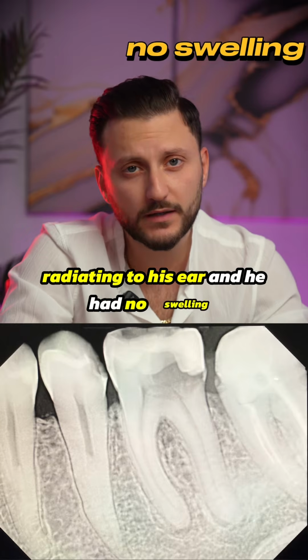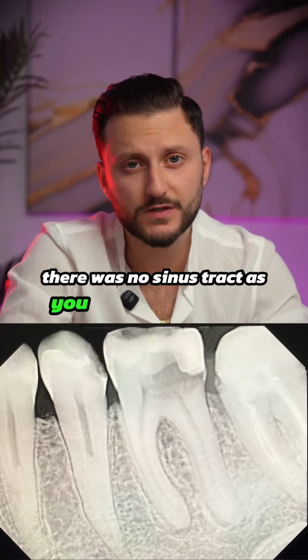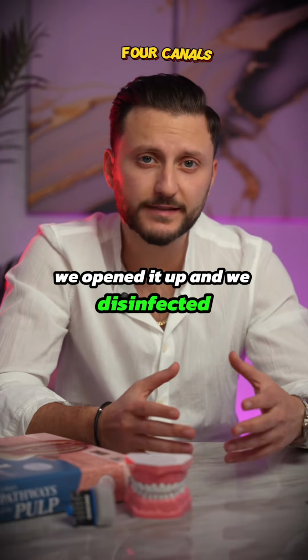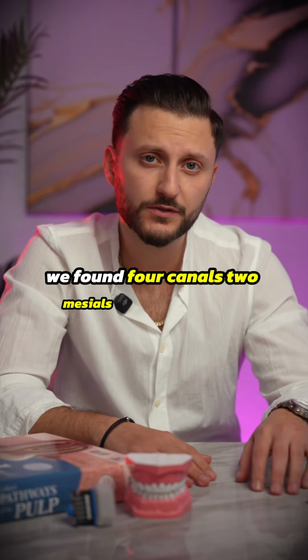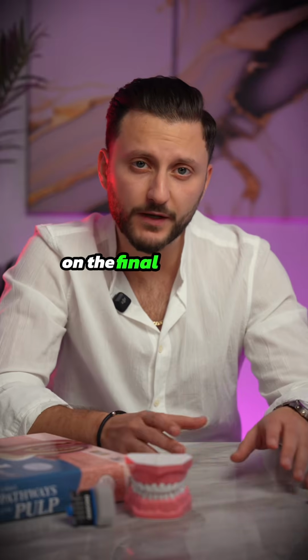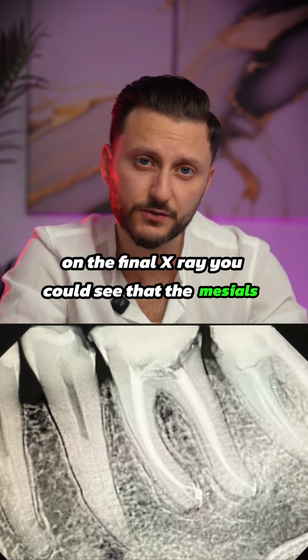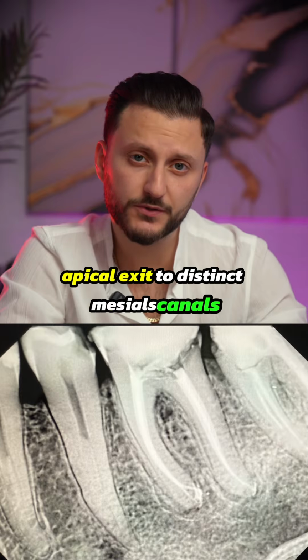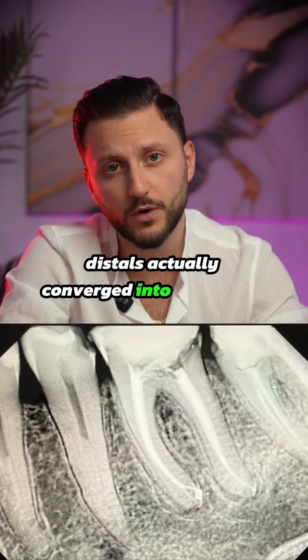and he had no swelling, there was no sinus tract, but as you could see on the x-ray, there's a big decay in the area. We opened it up and we disinfected. We found 4 canals, 2 mesials and 2 distals. On the final x-ray, you could see that the mesials have their own exit, apical exit, 2 distinct mesial canals. Distals actually converged into 1 apical exit.